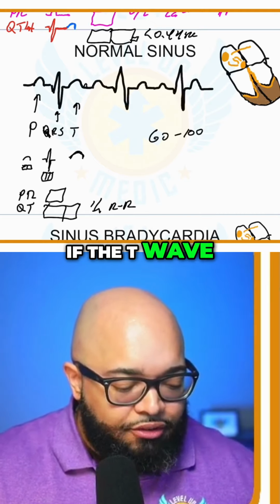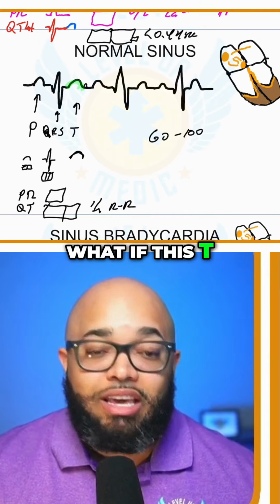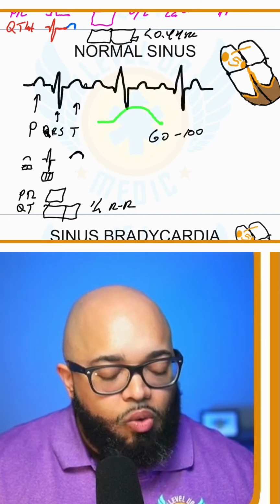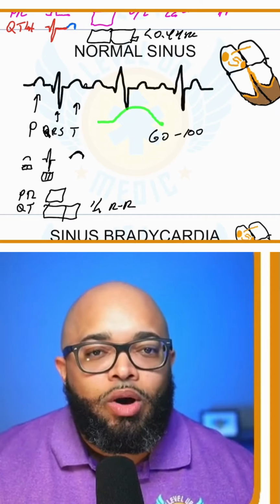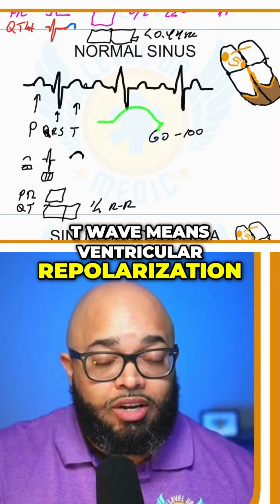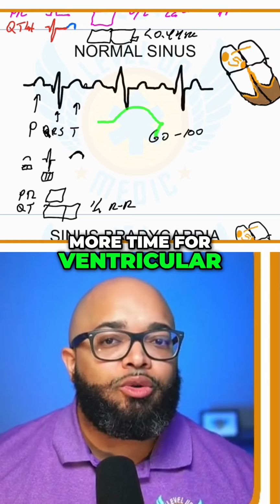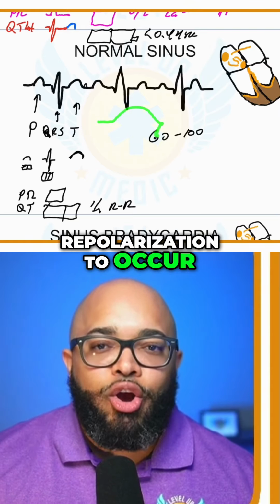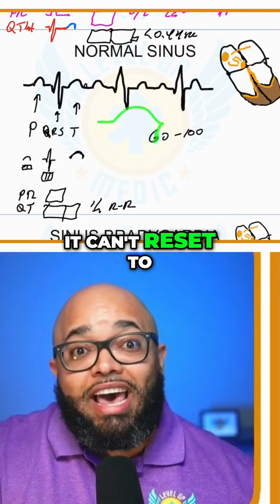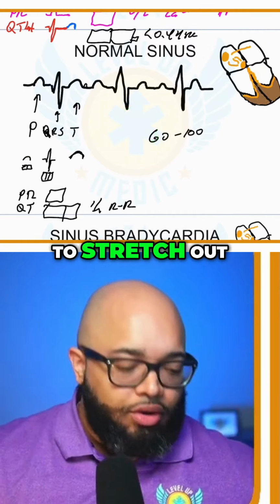What if the T wave, for instance, this is a normal T wave, but what if this T wave is wider? Well, we know that the T wave means ventricular repolarization. If it's wider, that means it's taking more time for ventricular repolarization to occur. But if the ventricle doesn't repolarize, it can't reset to be able to start the next heartbeat. So everything is going to stretch out.